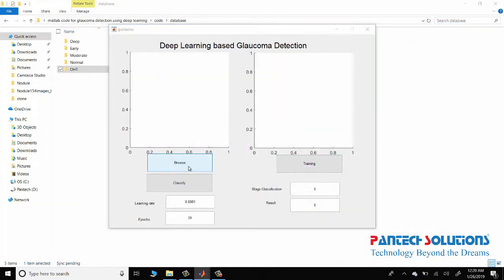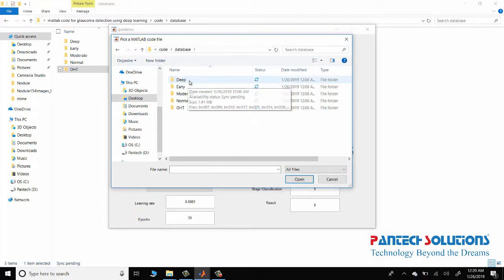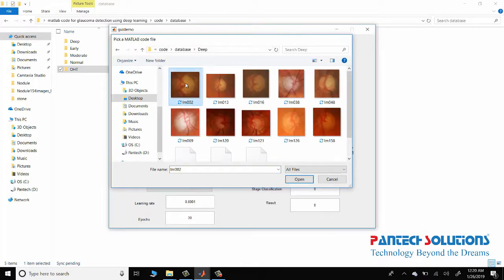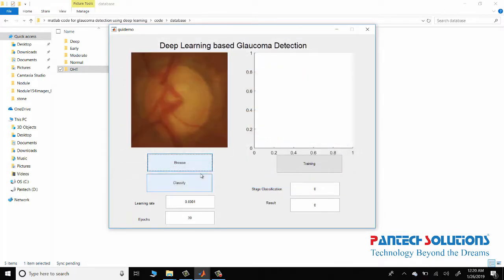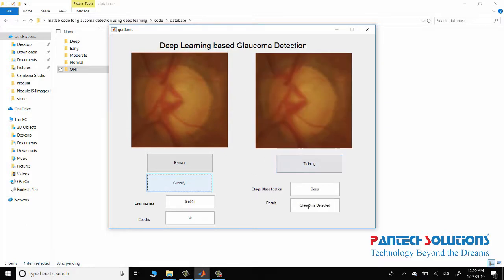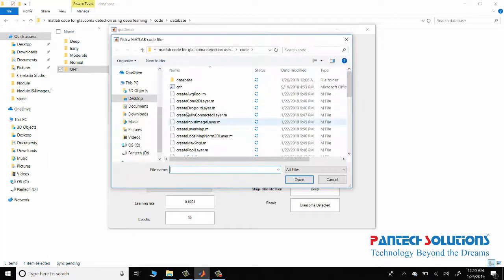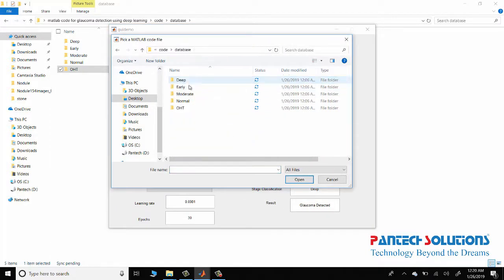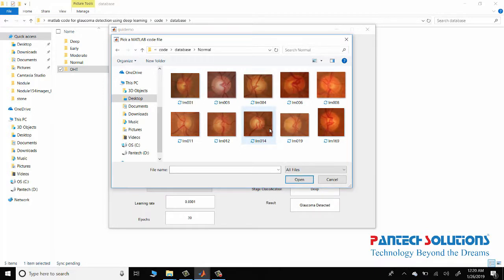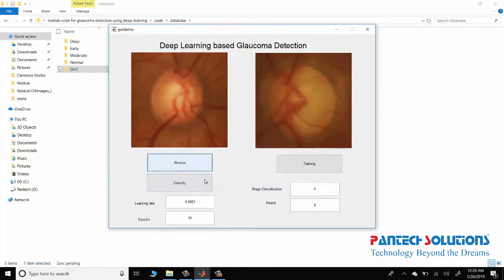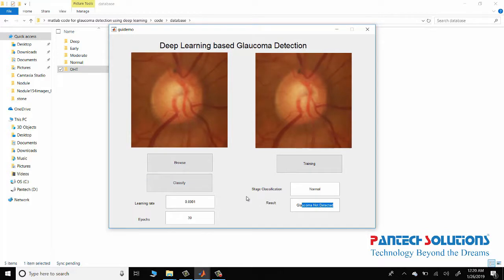So I'll browse and choose an image, and I am going to classify it. You can classify the stage classification as well as the glaucoma detector. I am going to view a normal image, classify — glaucoma not detected.